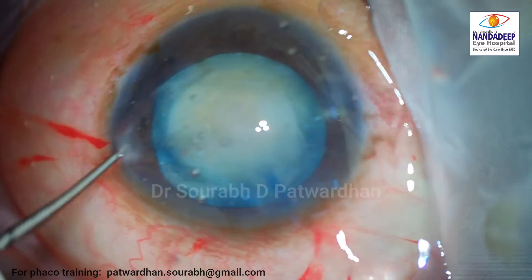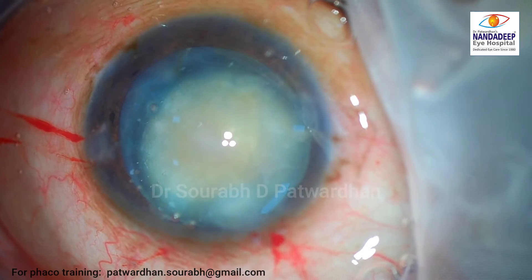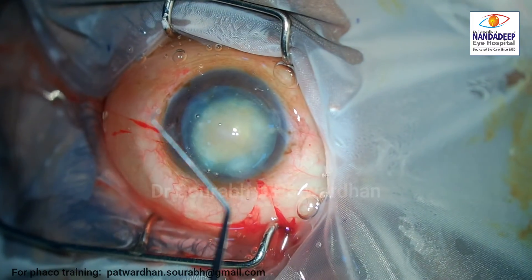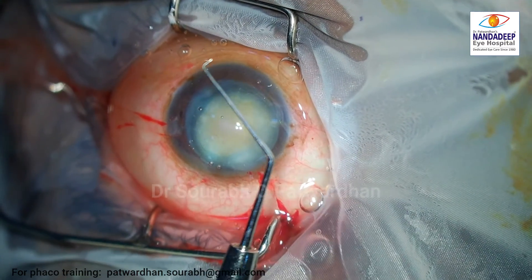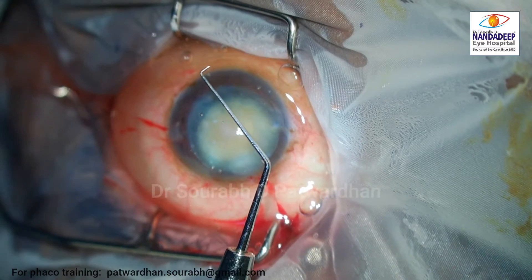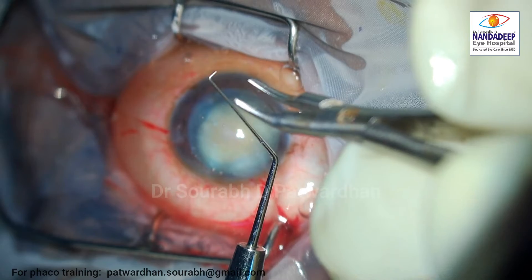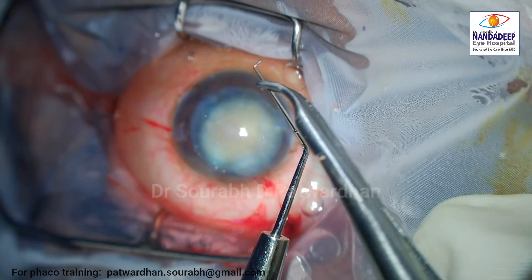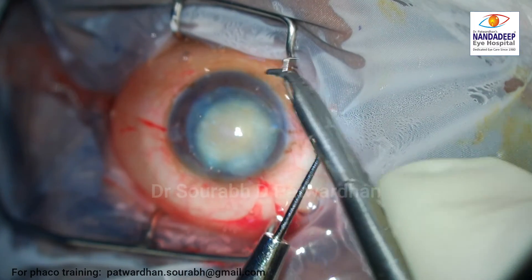In this particular case you can see the zonular integrity is quite good, which is a good plus point. Now, because this is a kind of shrunken nucleus, I need to do some horizontal chops, which will be easier to tackle. I decided to create what I call Patvardhan's hybrid chopper.